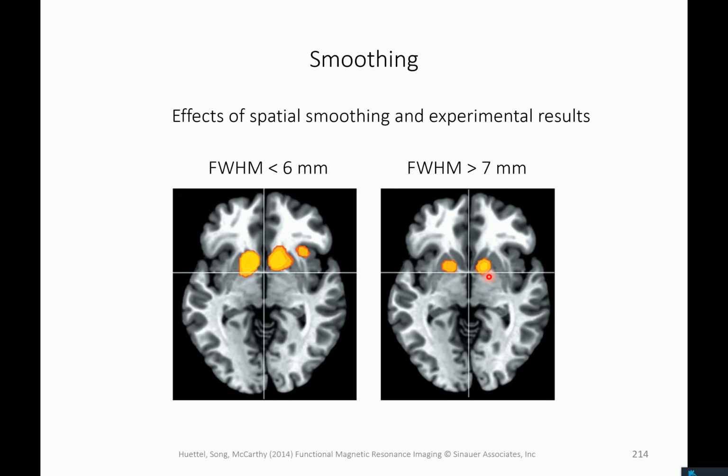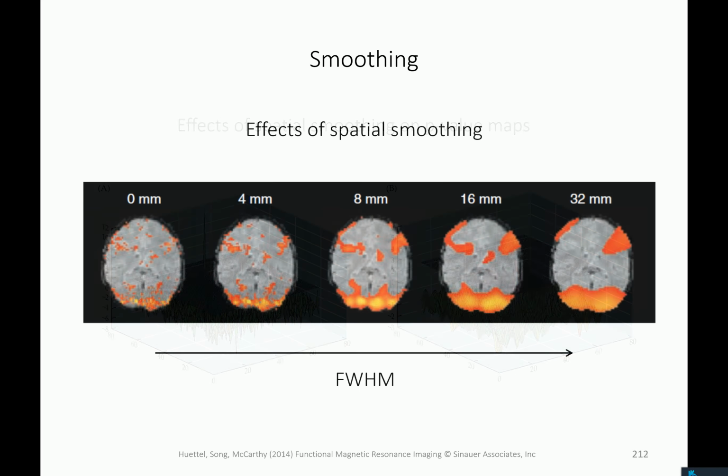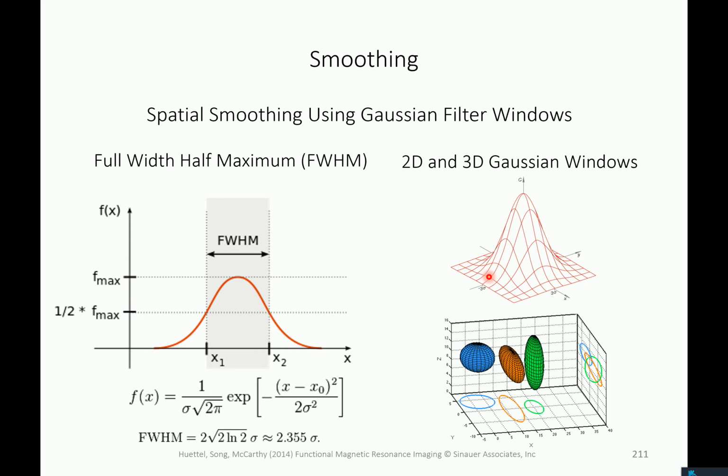I have a question regarding the Gaussian function, because you previously said that it's not acting as a probability distribution, but just a function. And I've read that you do smoothing in order to enhance your signal-to-noise ratio.